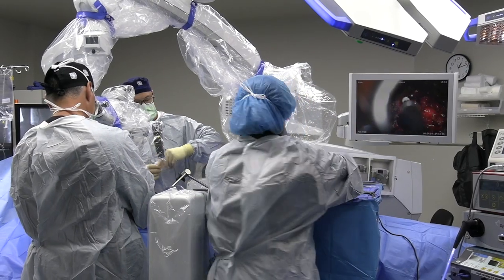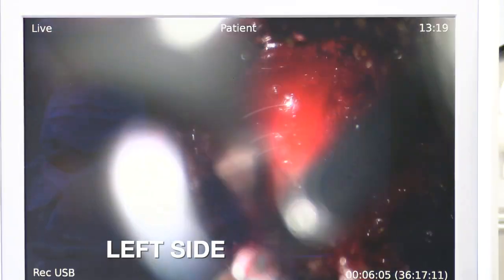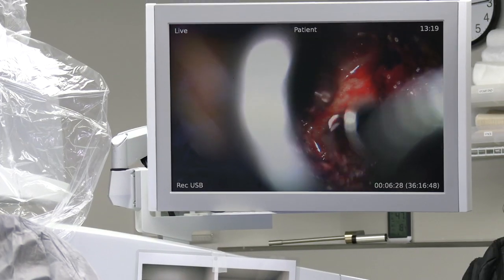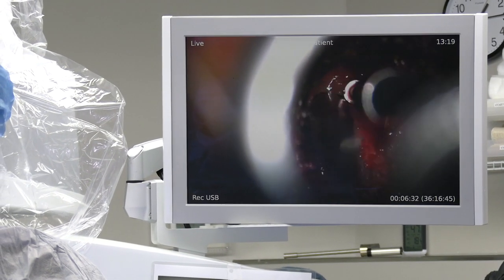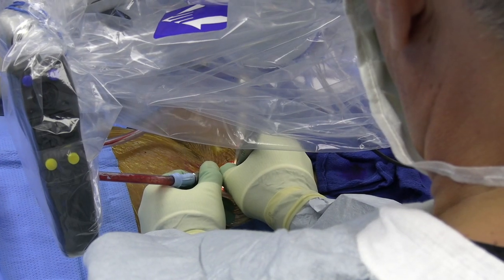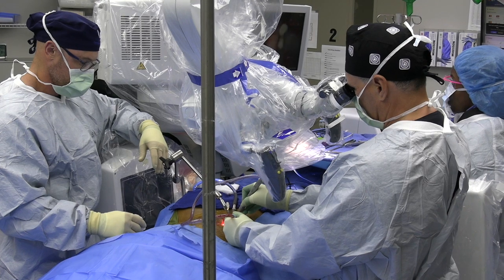So working across a little bit at a time here. This is the complete other side of her spine right here where I'm drilling presently. Over here is the left nerve root and over here is going to be the right side. Kind of fat right here and that's where the flavum is detaching, so I'm as far towards the head as I need to go. I need to work lateral on this side but I'm not pushing down on anything — it's gentle — and work up here a little bit.